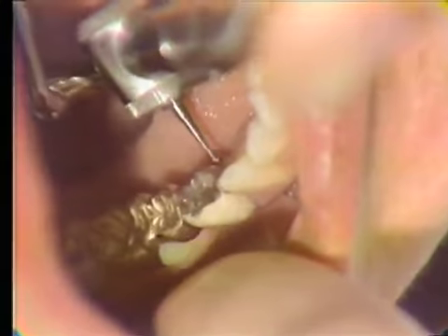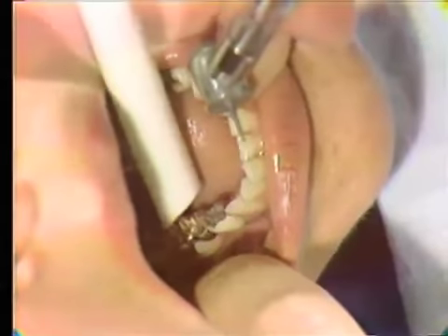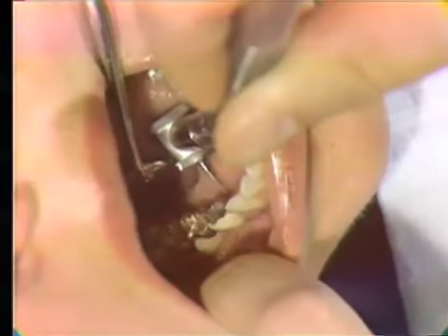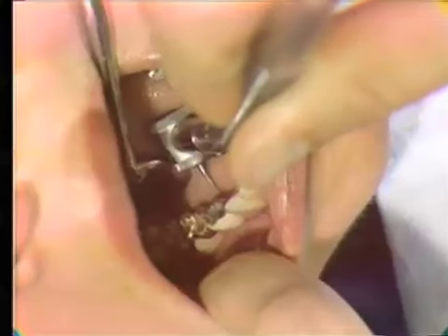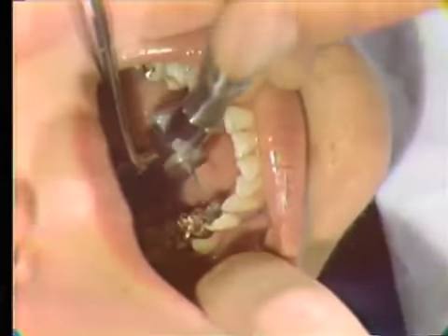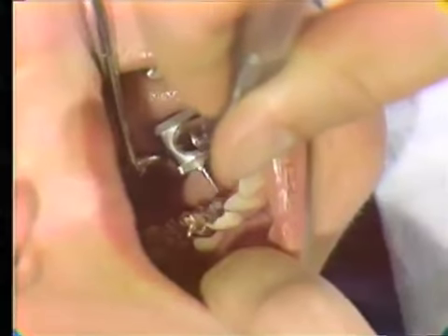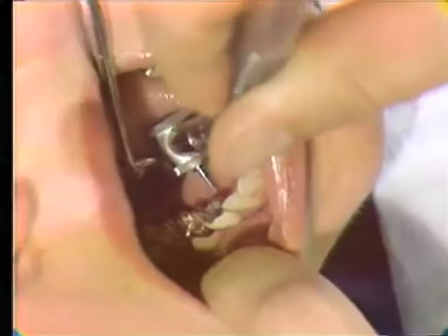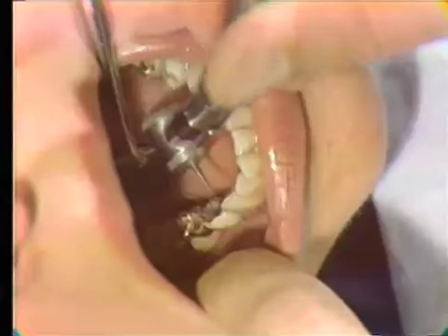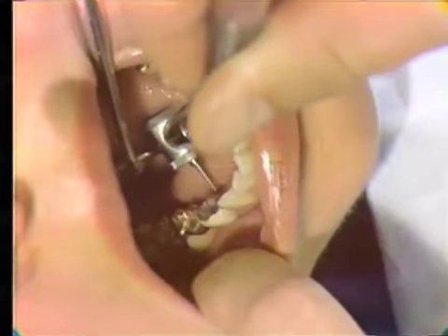Due to the limited space available when the lingual approach is used, intermittent evacuation is recommended as fluids accumulate. In addition, once the preparation is opened, it is often helpful to complete the preparation with a conventional speed handpiece. This eliminates the hindrance of the water coolant and offers the operator greater control. Due to the presence of the tongue, the mandibular posterior segments tend to be more difficult to treat. However, through the use of effective retraction by both the operator and the chairside assistant, access and visibility can be achieved.